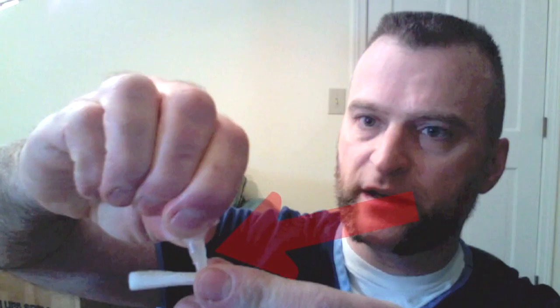You take some gel foam or other absorbable hemostat product and put some dermabond or other tissue adhesive on one side of it. The next step is to take the gel foam with the tissue adhesive on it and press the sticky side against the nasal septum. Don't do it backwards. I like to use a Q-tip with a little bit of bacitracin ointment on it to keep the gel foam from adhering to the Q-tip so I can press really firmly.